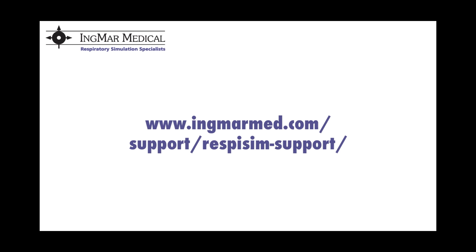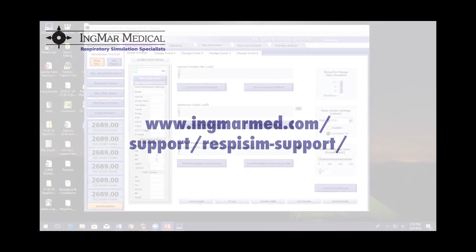One is about using the quick choice menu, and one is about using the interactive control panel. And the 4th one is about scripting, if you have any questions about that. So those are great resources to look at. Yeah, those are brand new videos. They were all developed in our latest software version that you're seeing here today. So as Kimber said, go ahead and check those out on our support section on the website.